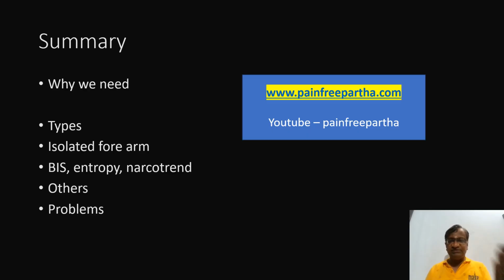So why do we need it? Yes, we need to decrease awareness, decrease the amount of drug used, and improve post-operative extubation time and PONV. Types are so many. Isolated forearm is the best one. Then come BIS, entropy, Narcotrend and others like index of consciousness and PSA 4000. There are a lot of problems. The main thing is about transition.